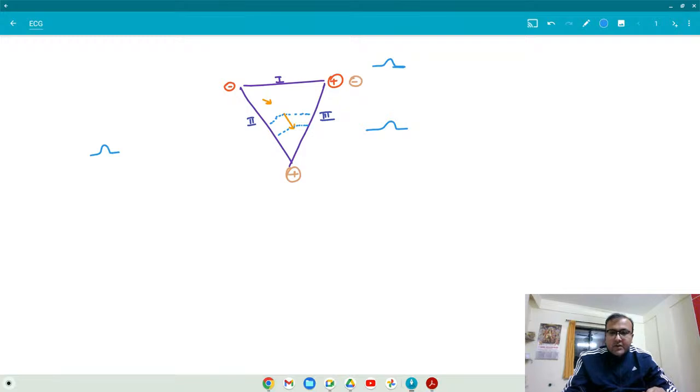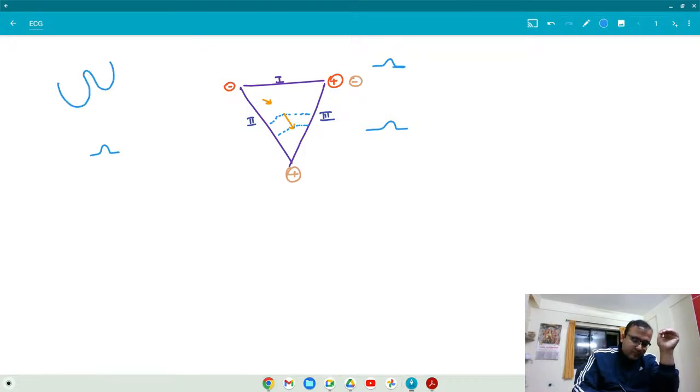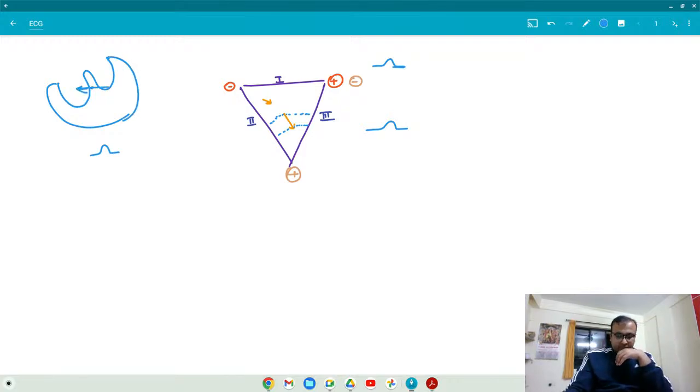Now let us think of the same thing, but this time we will look at the major ventricular depolarization. So first think about major ventricular depolarization in lead 1. In lead 1, what is going to happen during the septal depolarization? You remember septal depolarization? Remember or not?